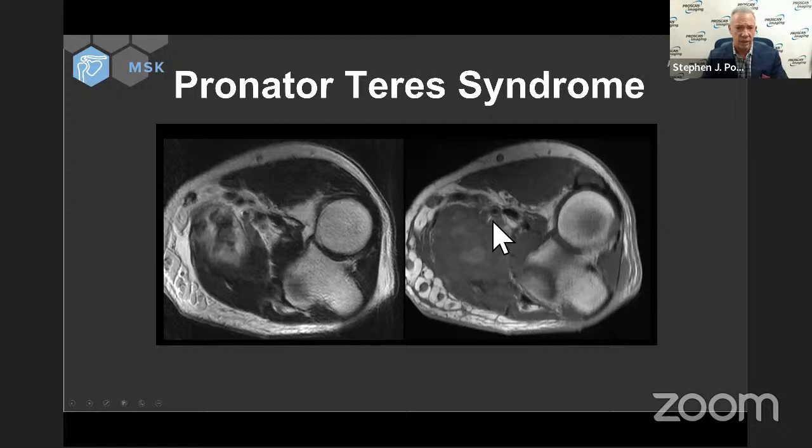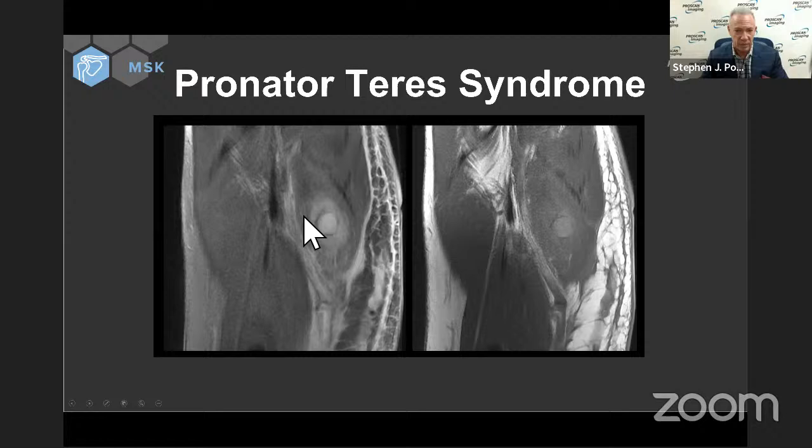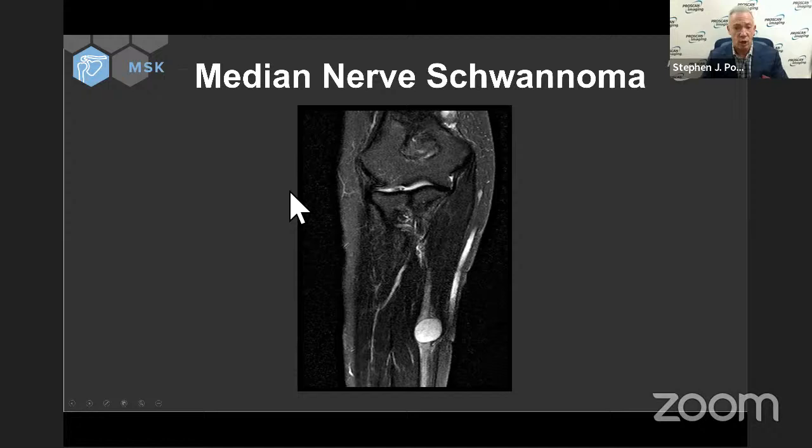So this is somebody that suffered from pronator teres syndrome. There is our hematoma involving the flexor pronator mass. Look at the signal of our median nerve, which is one of the bigger nerves in the body. It looks almost like a vein. It's too big. It's too bright. This is pronator teres syndrome, also known as honeymoon paralysis. You know, because sometimes when you're on your honeymoon and you fall asleep and your new partner's head is on your arm, you don't turn to them and say, darling, your head is too heavy. You just go to sleep. And when you wake up, you have honeymoon paralysis.